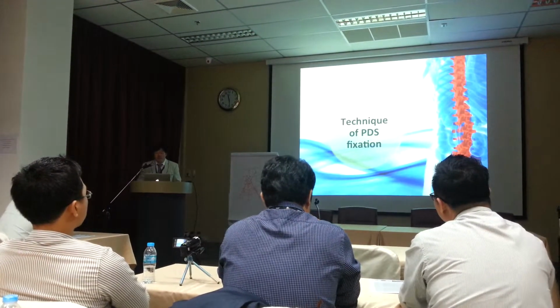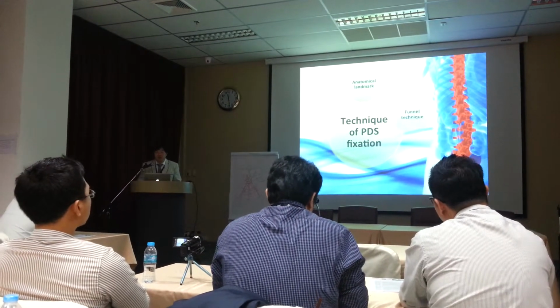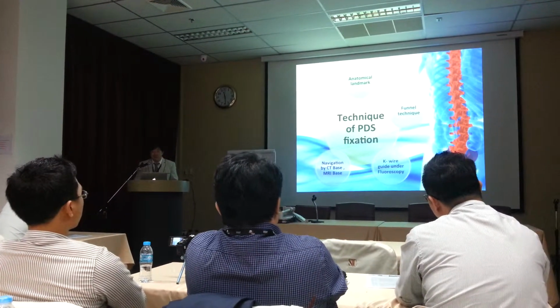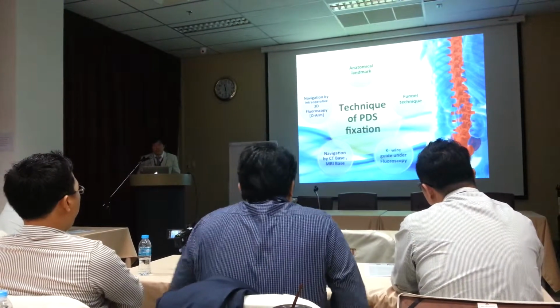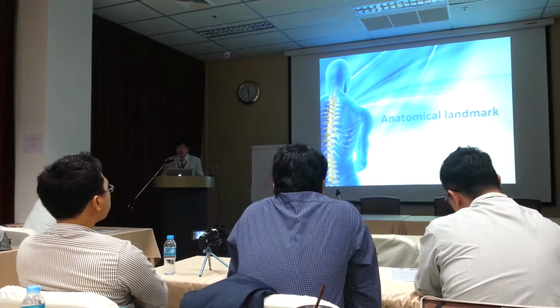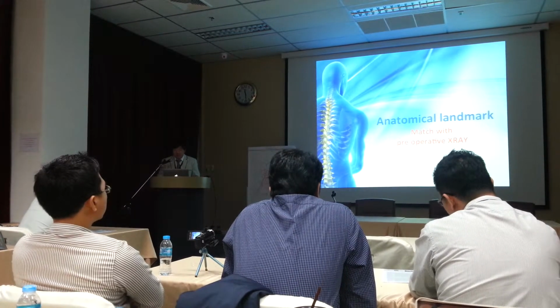The technique of the fixation, first I divide into anatomical landmark, the funnel technique, K-wire guide under fluoroscope, navigation by CT or MRI base, and the last is navigation by intraoperative 3D fluoroscope or the O-arm. The first technique, anatomical landmark: you must map with the preoperative X-ray.